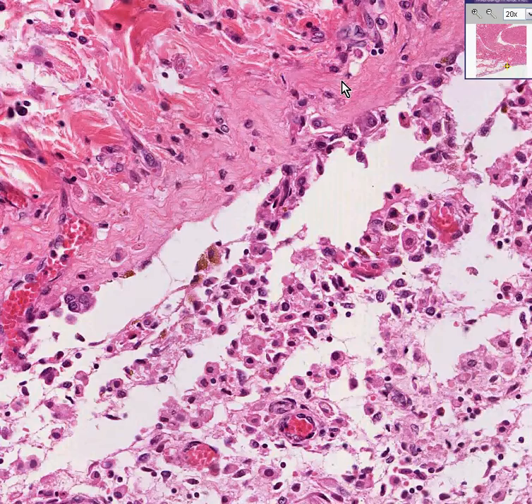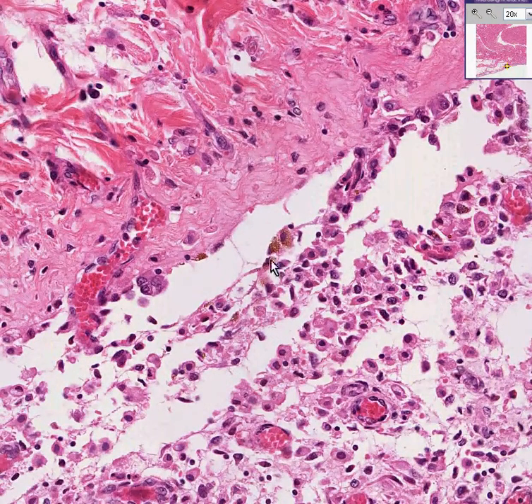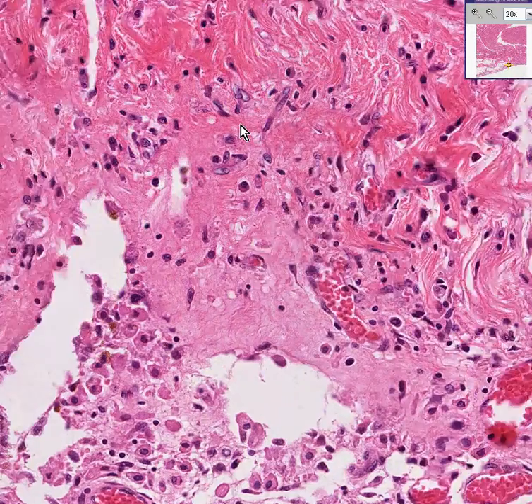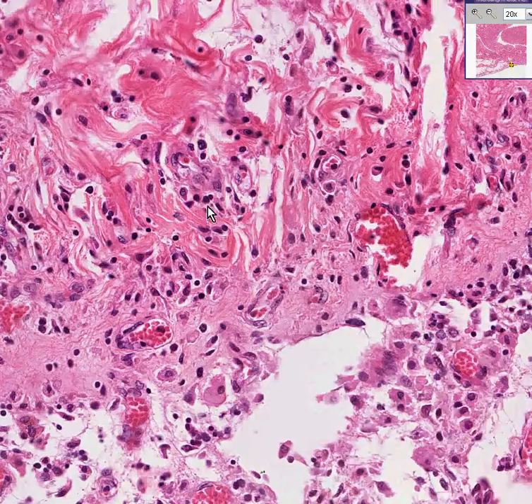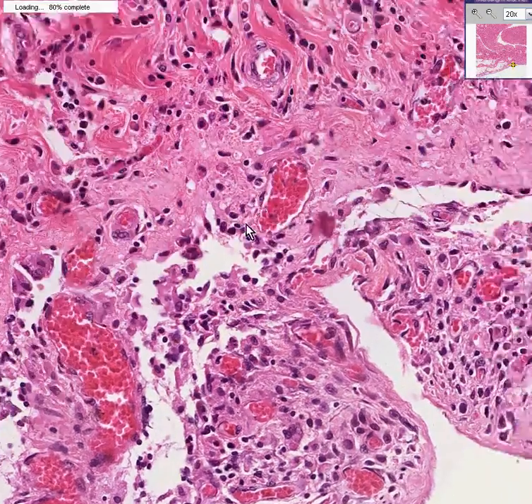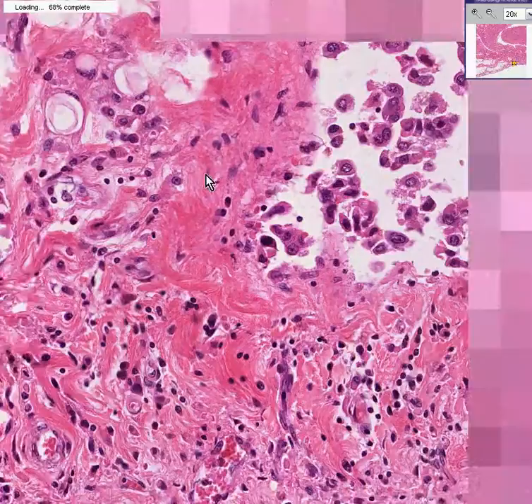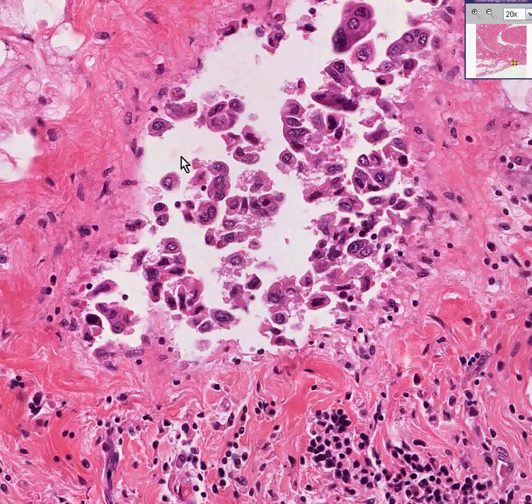But if you want to find some, and look at, here's some cells out here, which are macrophages that have chewed up some of the blood pigment or hemosiderin. And if you see any areas, however, where you're absolutely sure there are tumor cells, please stop me. Now we're in the area where the pericardium was kind of plastered up against the myocardium. So maybe the reason for that is maybe there's more tumor nests out here. Sure enough, here's a large tumor nest, isn't there?